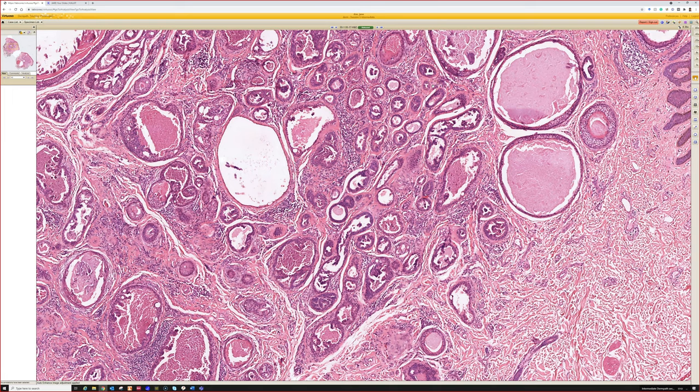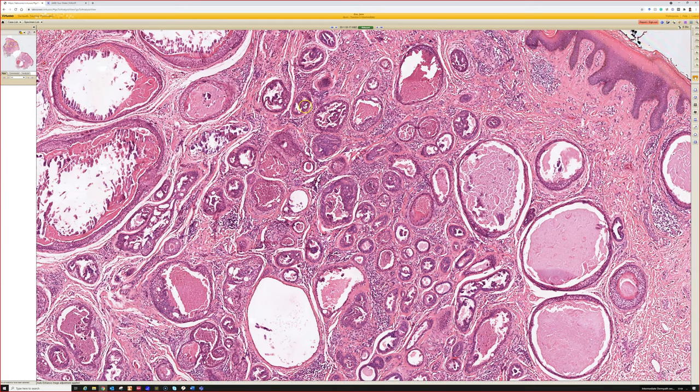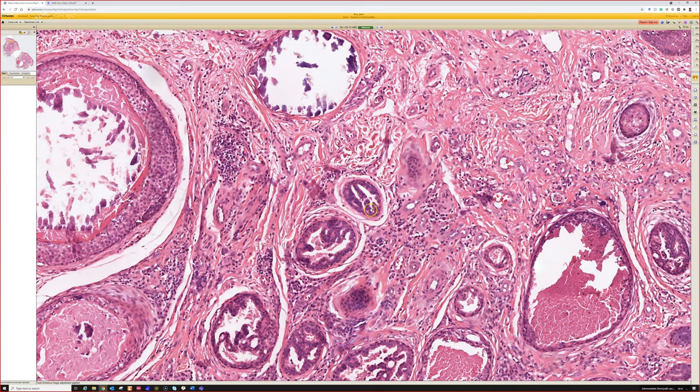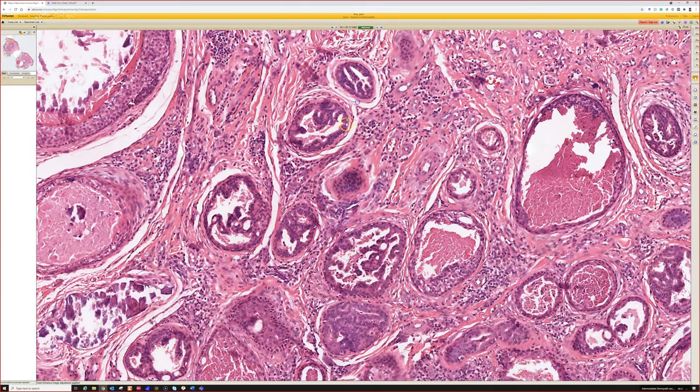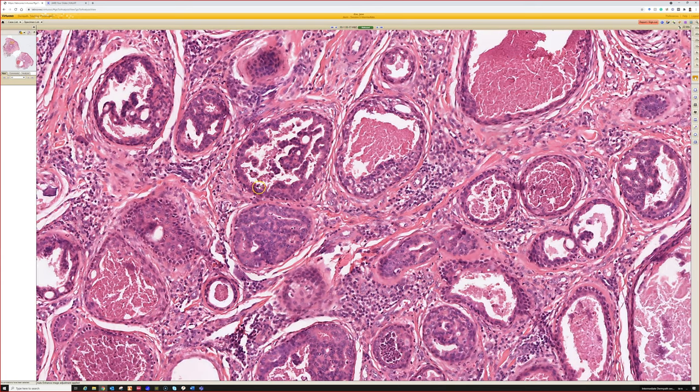They're so rare, and I've only seen a small handful of them. So maybe I'm not the most expert person on this in the world. Maybe someone who's seen more of them knows. In any case, they're both benign sweat gland and sweat duct proliferations. They tend to have a lining that has little papillary or micropapillary structures in it, like you can see here, these little tiny fingers and islands of floating tumor cells.